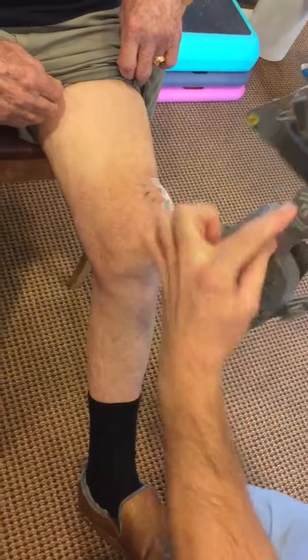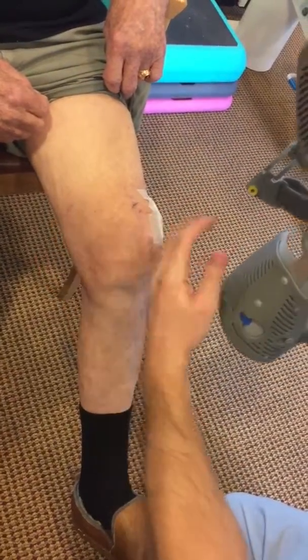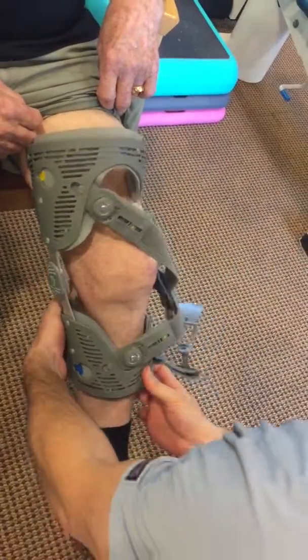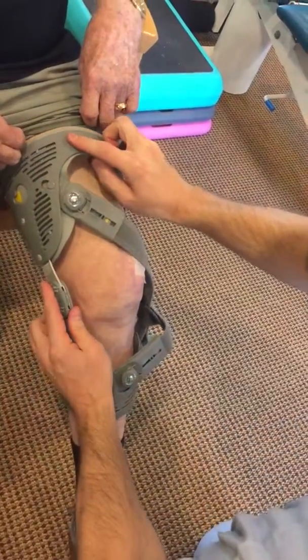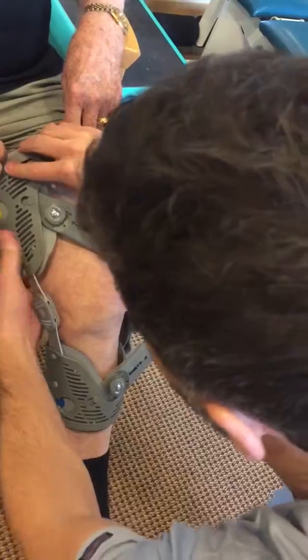First things first, we want the middle part of the hinge to be equal with Bob's kneecap. We are going to apply it just so, just like that. Now I can see his kneecap and the hinge are at the same level.